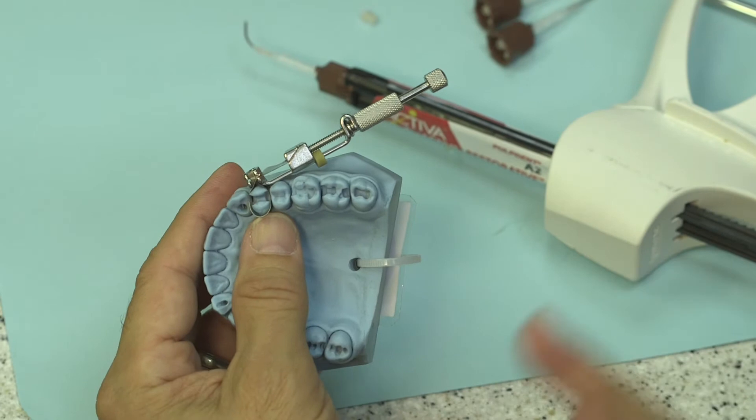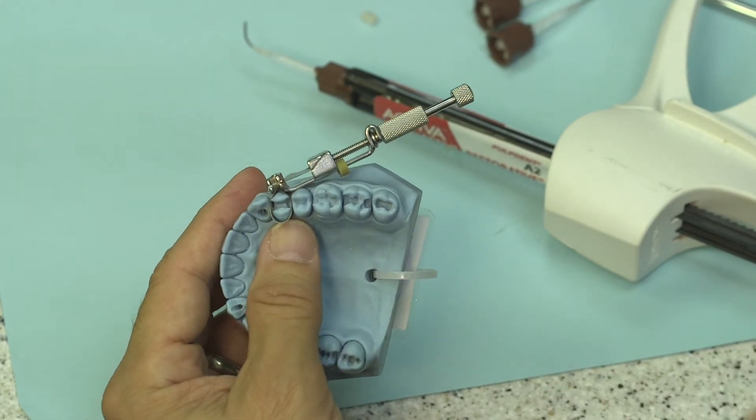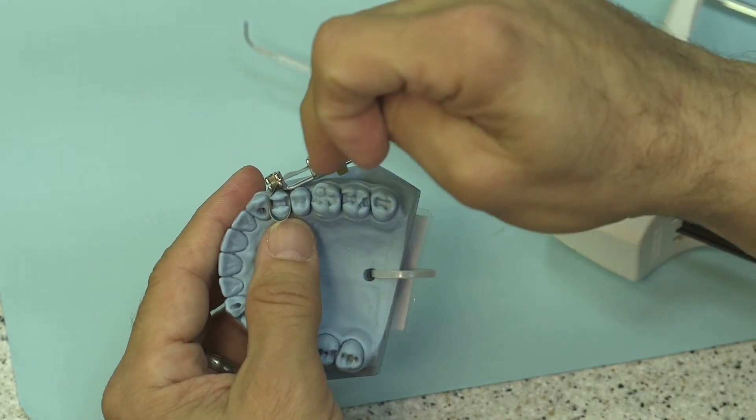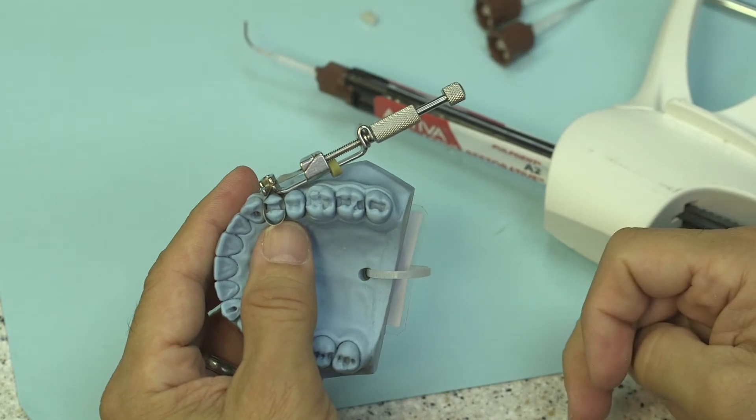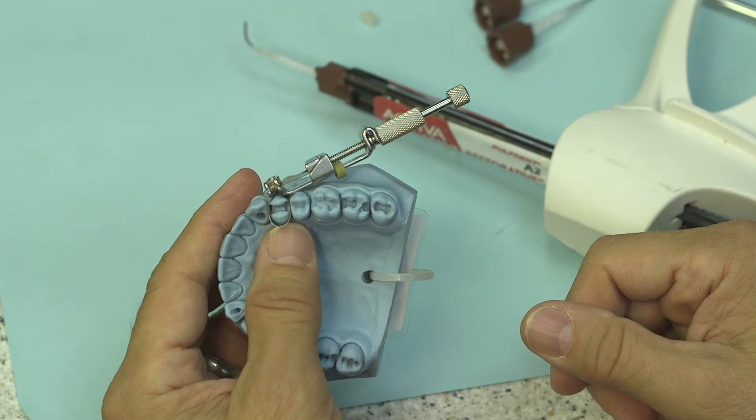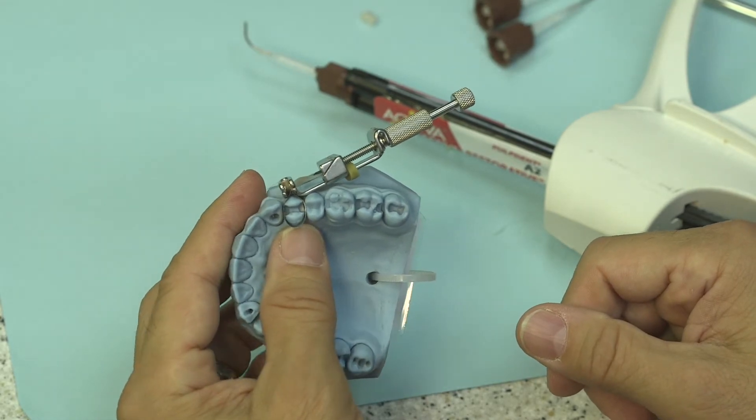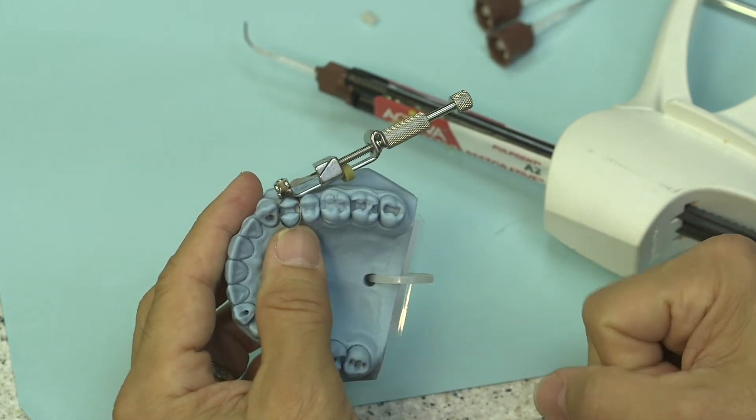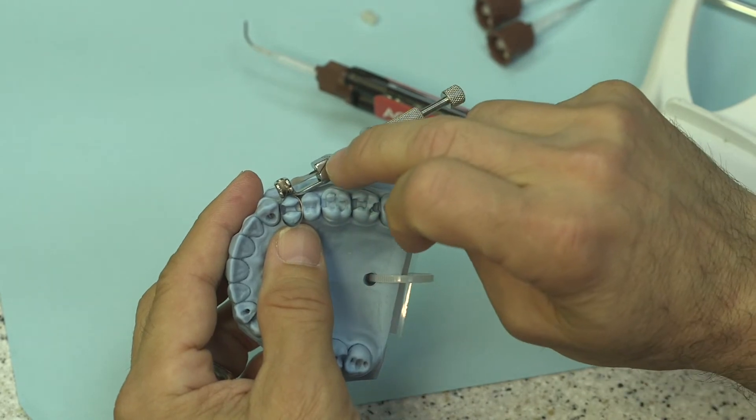I'm also doing it a little differently than you were taught in dental school, in which the occlusal groove for the Toffelmeyer is traditionally placed toward the gingival. My good friend Denny Brown with Greater Curve Matrix Bands has always recommended that you have the groove toward the occlusal.